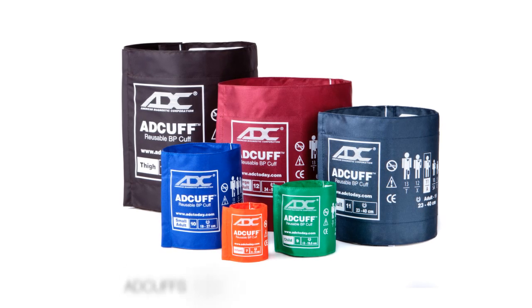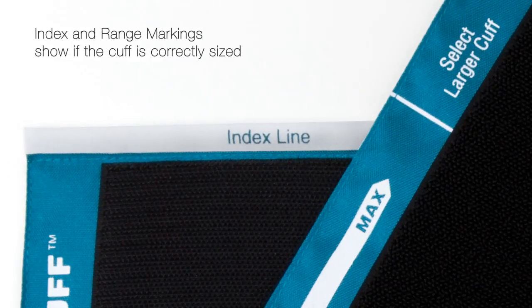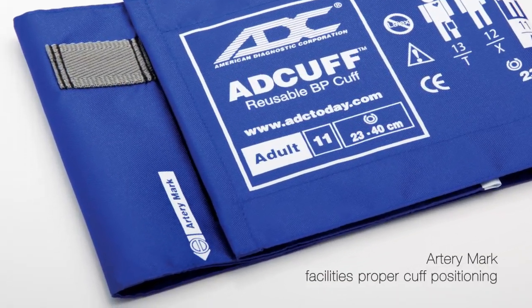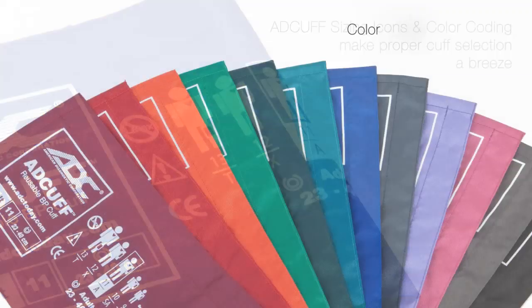Cuffs typically come in a variety of sizes to improve measurement outcomes, and ad cuffs are no exception. The ad cuff's proprietary size guide marking system is among the most comprehensive available. Artery, index, and range indicators combined with vivid graphics and color coding simplify cuff selection and use.